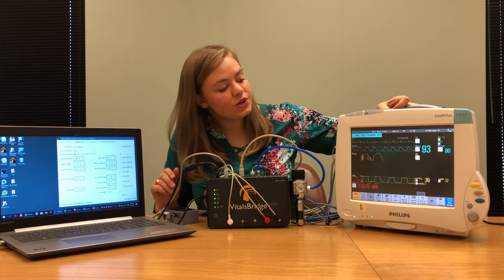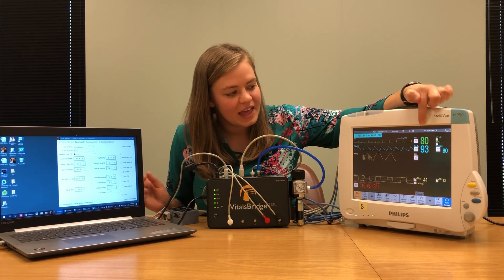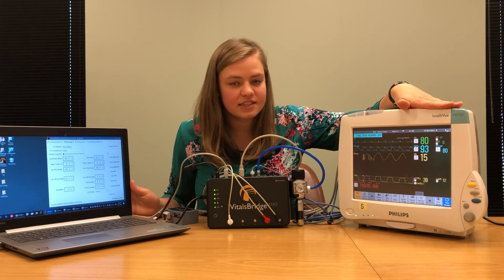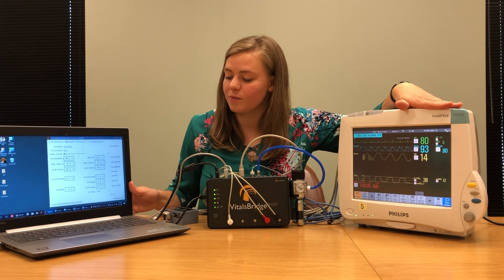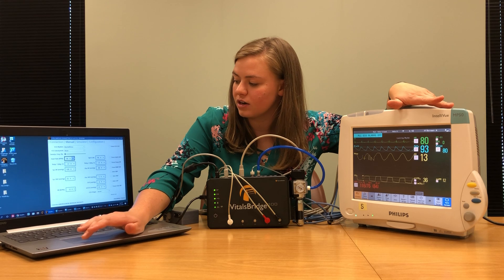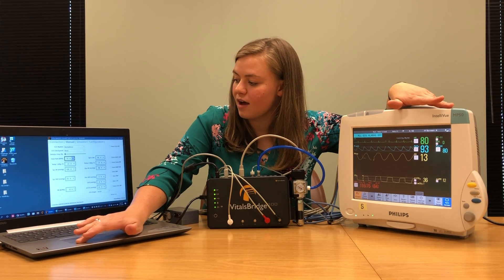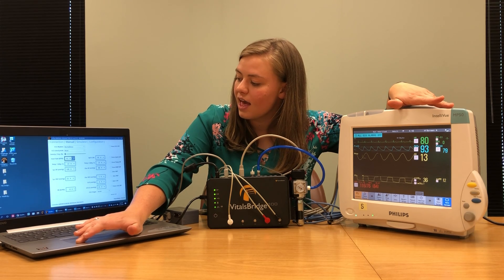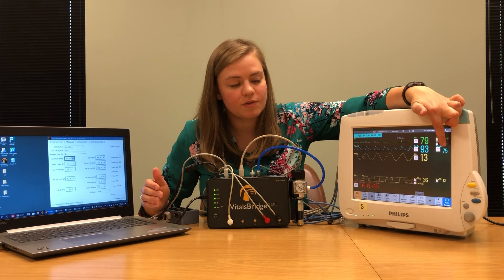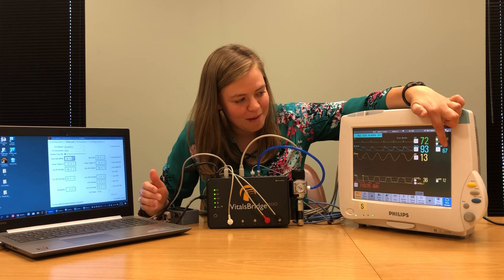Once you have that plugged in, you should see an ECG waveform as well as a heart rate come up. To verify the ECG and SpO2 signals are working properly, I'm going to change the heart rate on my VitalsBridge connector app. I'll drop the heart rate down to 60 beats per minute. You'll notice how the heart rate for the ECG and the heart rate for the SpO2 both drop to 60 beats per minute — exactly what we hope would happen.